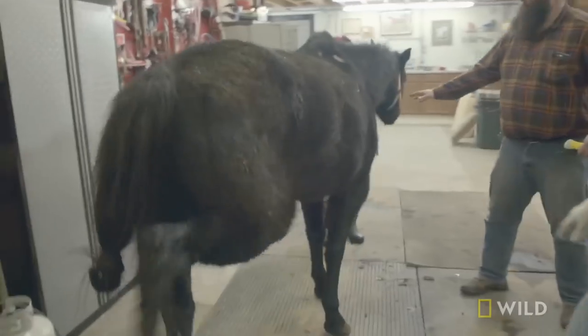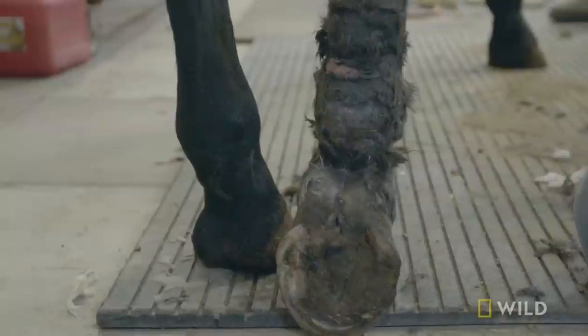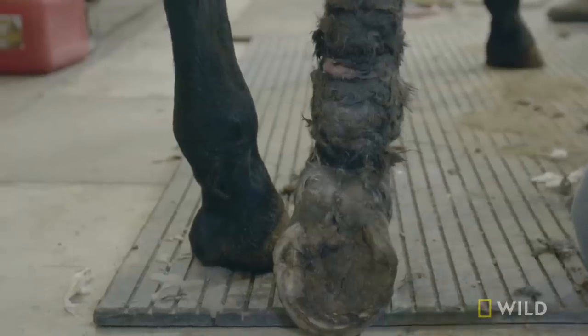Watch out. Hold him up. As soon as I got the cast off, he got a little jumpy. When we took it off, he didn't have that support, and all of a sudden he was kind of freaking out. He's been in this cast, so his muscles and tendons are like jelly. We don't want him to take a huge step or slip and fall and then tear everything to pieces again.